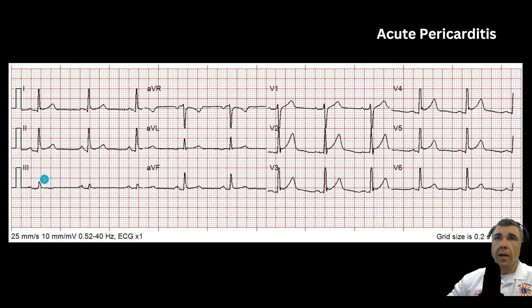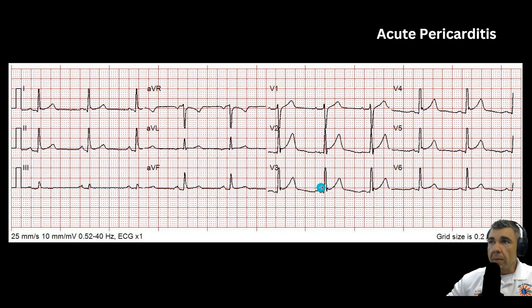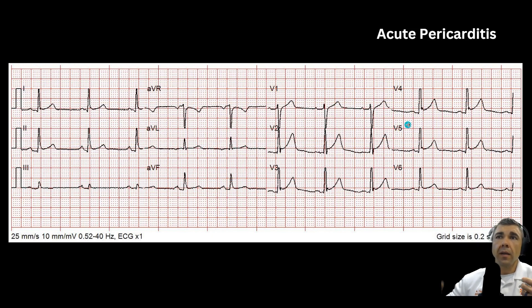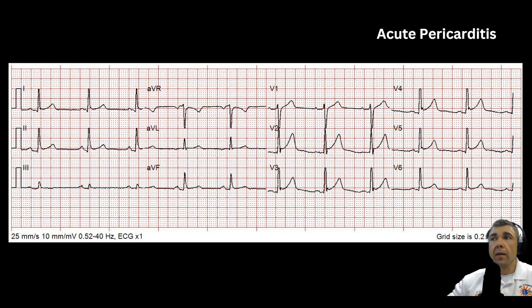Here's another example of acute pericarditis. The other thing is it looks a lot like early repolarization — many of you may have learned about the notched J-point with early repolarization. Acute pericarditis is an early repolarization pattern, and if all you had was the 12-lead, you wouldn't be able to determine whether it's acute pericarditis versus early repolarization. It's the patient presentation that helps you figure out which one is which.